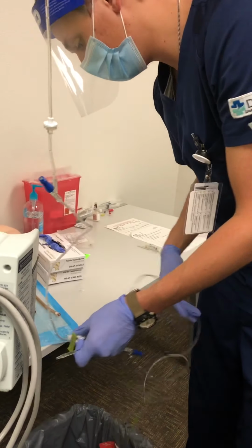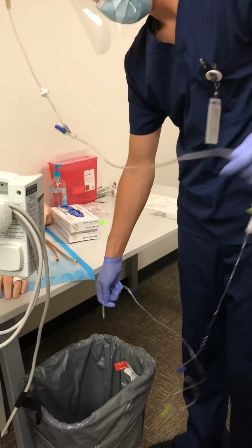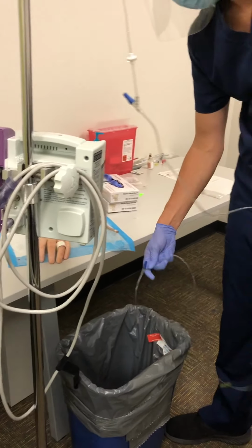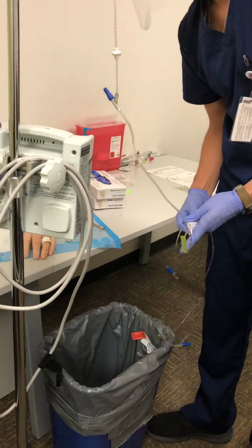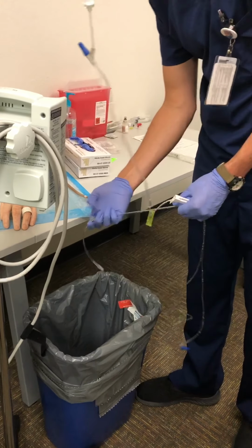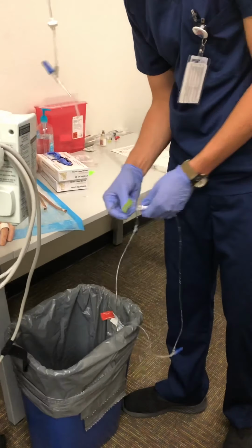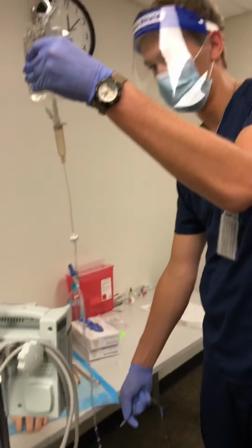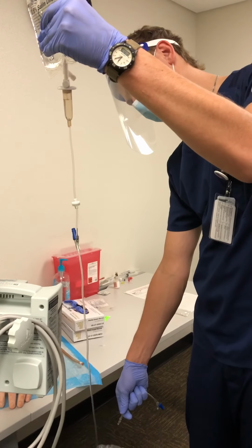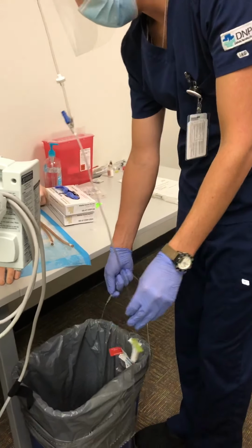Make sure that this is all open. And making sure we get all air bubbles out.